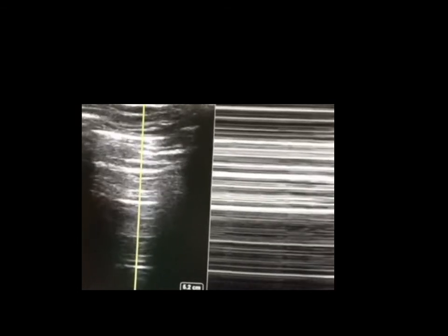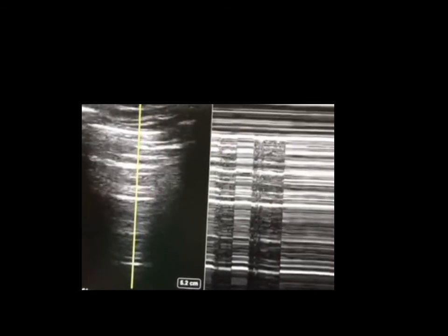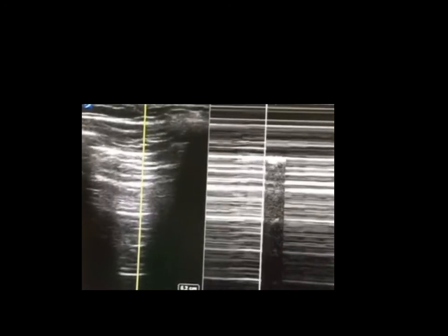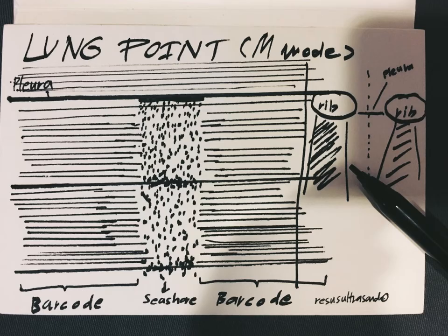Let's review this again to see the lung sliding creeping in — where there is no lung sliding at all at the same probe position, there is no movement. As shown in the diagram, you have the pleurals below: the barcode side where nothing is moving, and then there is a seashore side as stripes lying on top of the barcode side. This is the lung point sign.